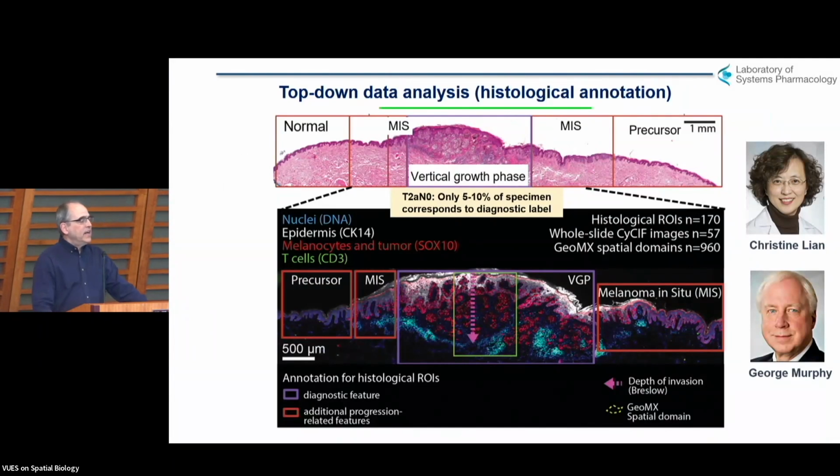So one of the things that comes to the fore as you begin to work on this is that specimens as acquired from the clinic typically contain multiple disease stages. And so this has led us to realize over the years that an absolutely essential first step, and I'm going to come back to this several times in my talk, is histopathological annotation. What you see on the top here is an H&E, the pink and purple image, been around since the late 1890s, invented like most of histopathology by a bunch of creative German chemists. And that is still the dominant modality.